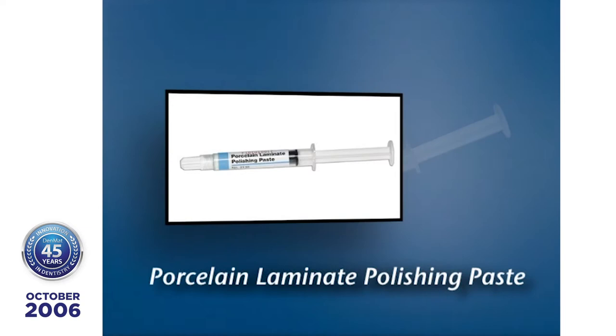Just before we started, Lisa polished his teeth with porcelain polishing paste, and that's a non-aqueous fine particle. You get that non-aqueous pleasant tasting paste that we use on porcelain, but I like to use it because it contains an enzyme in there to remove the plaque on the teeth.